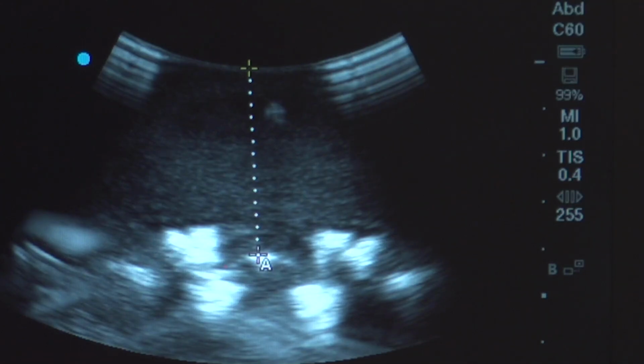This depth is an anticipated minimum depth because it does not accurately account for the needle insertion angle and compression of the skin and subcutaneous tissue by the transducer. Some challenges at assessing depth in this view: the inability to visualize the canal ring and mistaking posterior vertebral body for dural depth, or mistaking the transverse processes for dural depth. This is another reason that taking depth in multiple views can be beneficial.